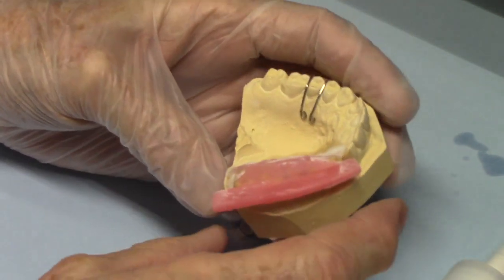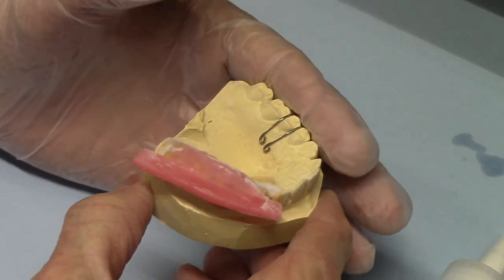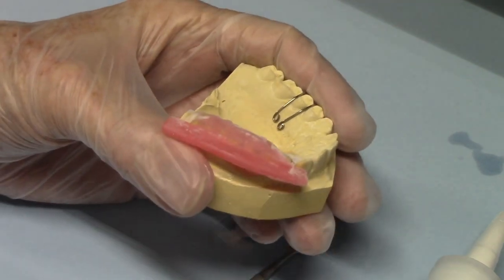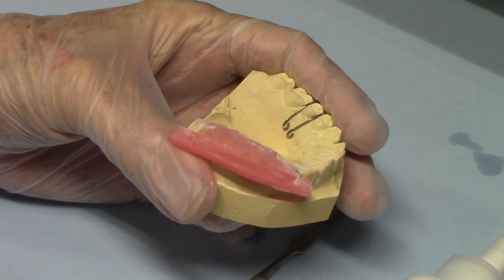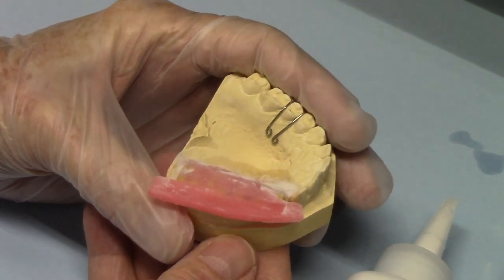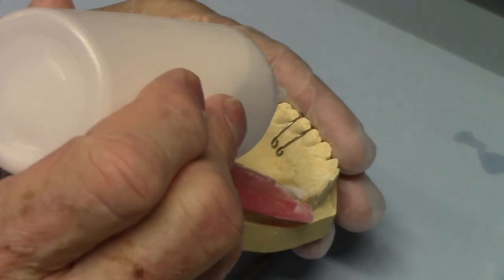Now here's what I'm going to show you in this video. You'll notice I've got a glove on this hand. You can use a latex glove — this is a vinyl glove. I use vinyl because latex gloves can get caught in the handpiece, which gets dangerous. So look how I'm going to just put my hand right here — I'm going to use this as a dam.